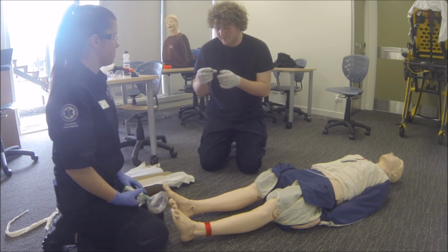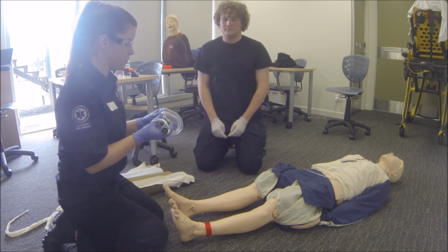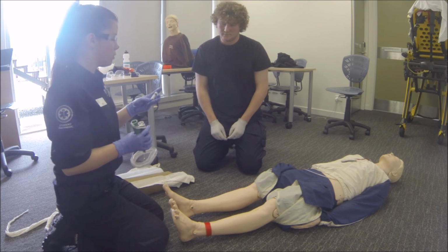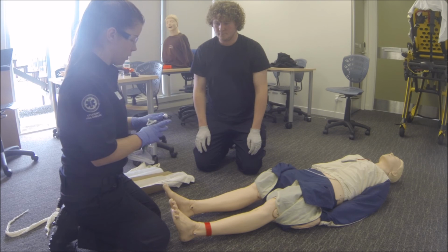Methoxyflurane 3 mils 2017. So I'll be administering the methoxyflurane through the green whistle and using a mask to prevent any secondary inhalation from myself or my offsider. I'll be using 3 mils. In a patient over 12 years old, I can give 6 mils, but I'll be starting with 3. So I'm just going to pour this into the whistle.